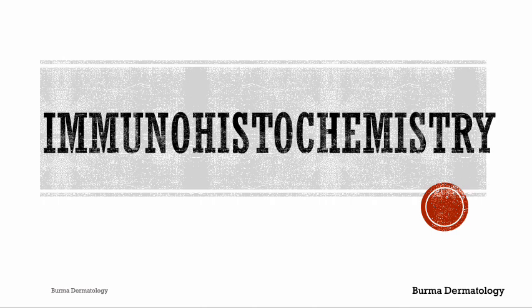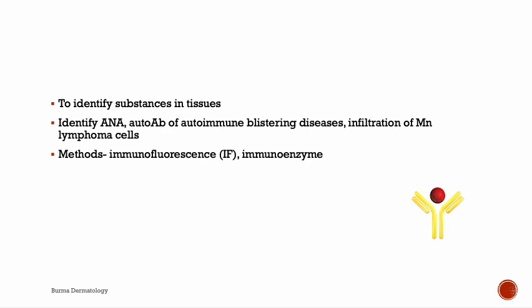Today I would like to talk about immunofluorescence, which is an important diagnostic tool in some diseases in dermatology. Immunofluorescence in dermatology can detect antibodies bound to antigens in circulating body fluids or tissues, which is an adjunct to clinical and histopathological diagnosis, especially in autoimmune vesiculobullous diseases and connective tissue disorders.